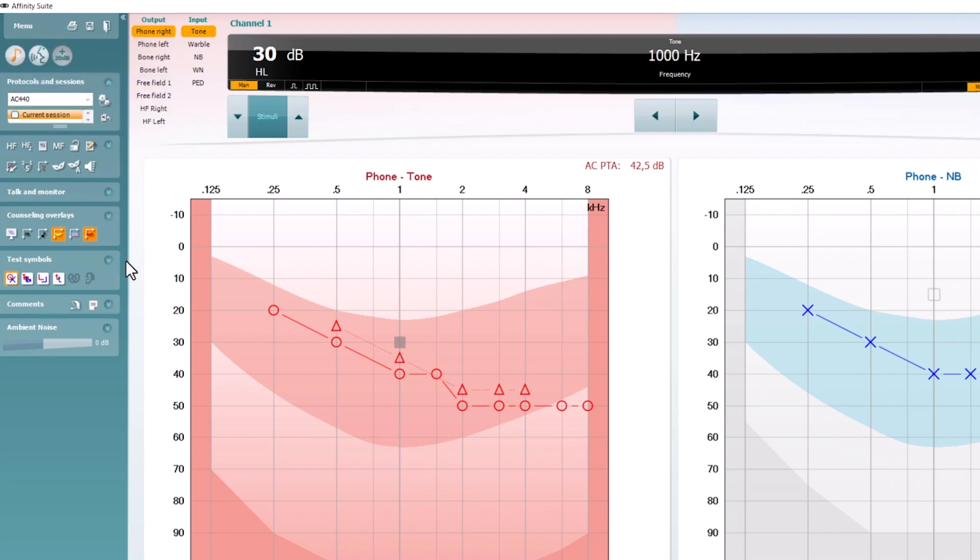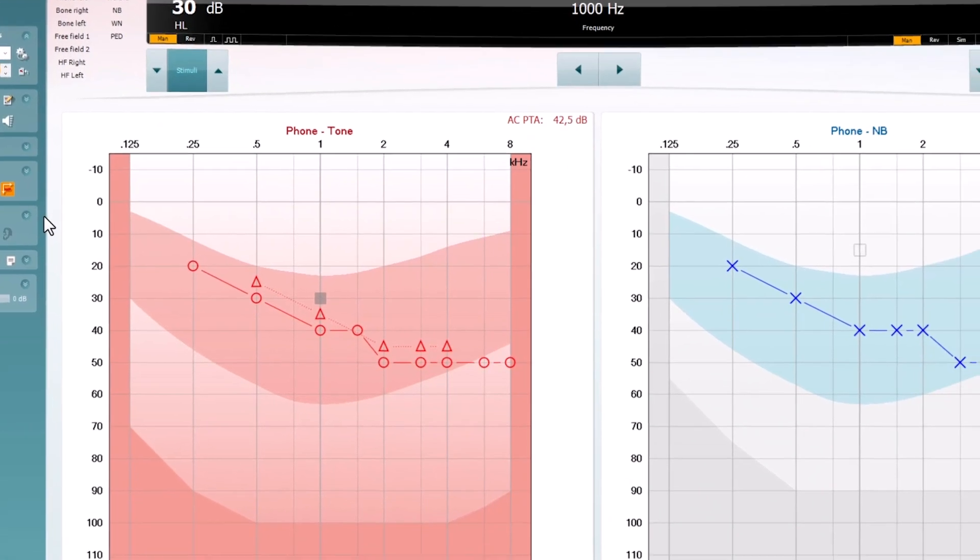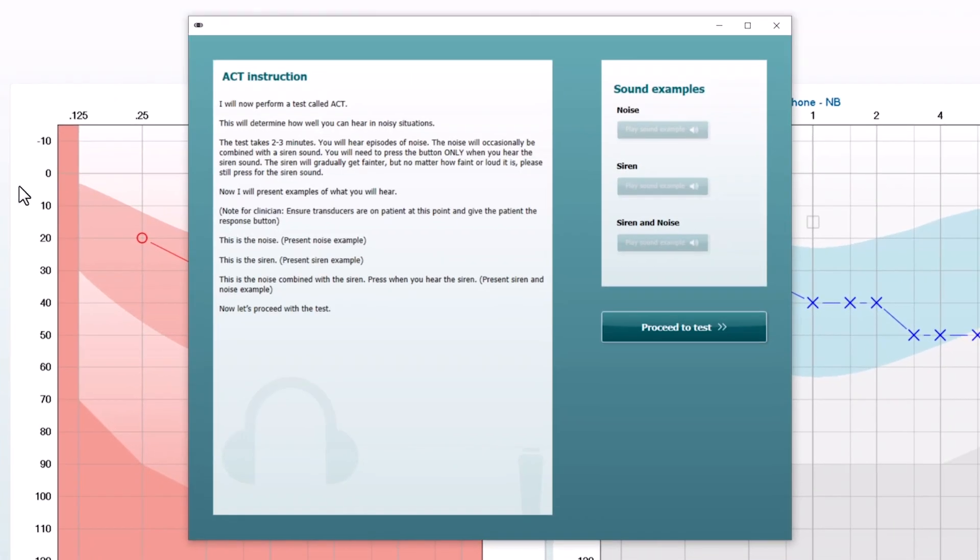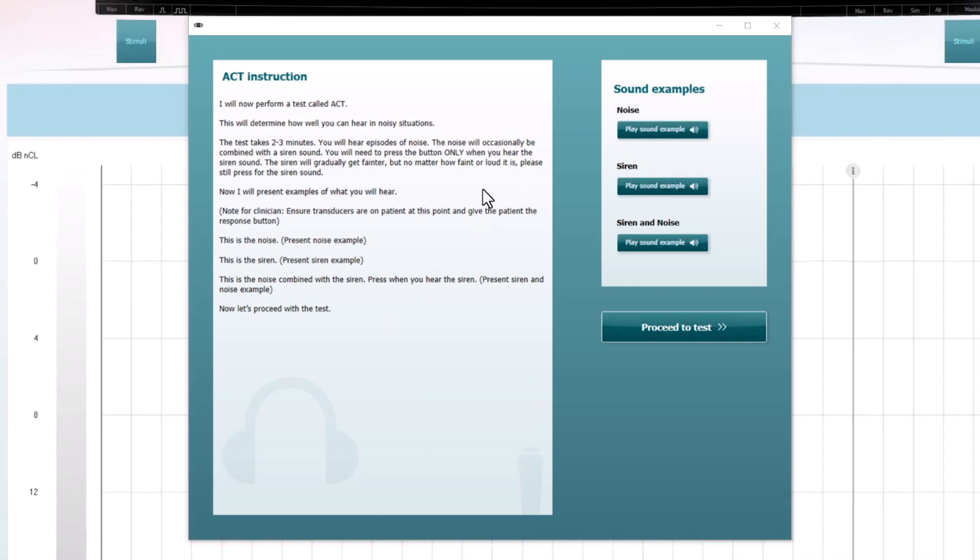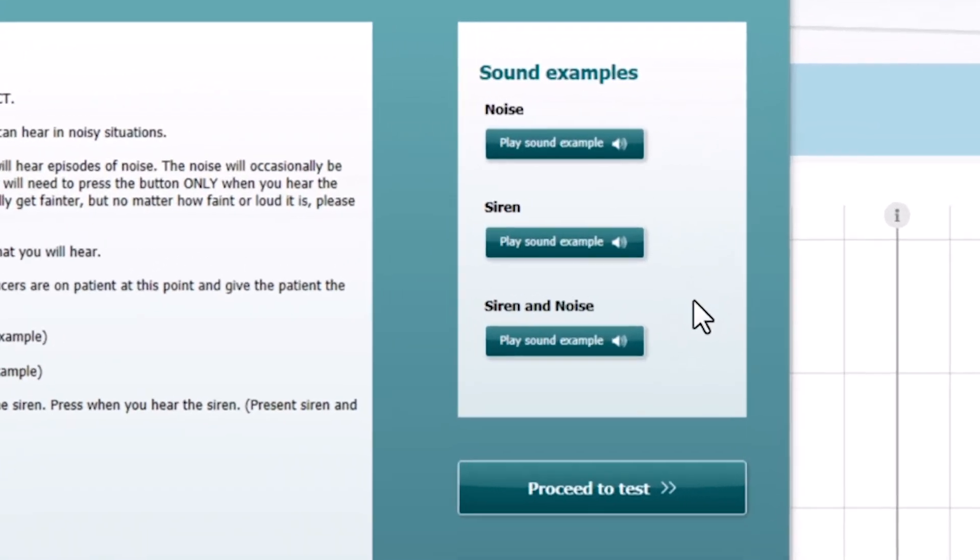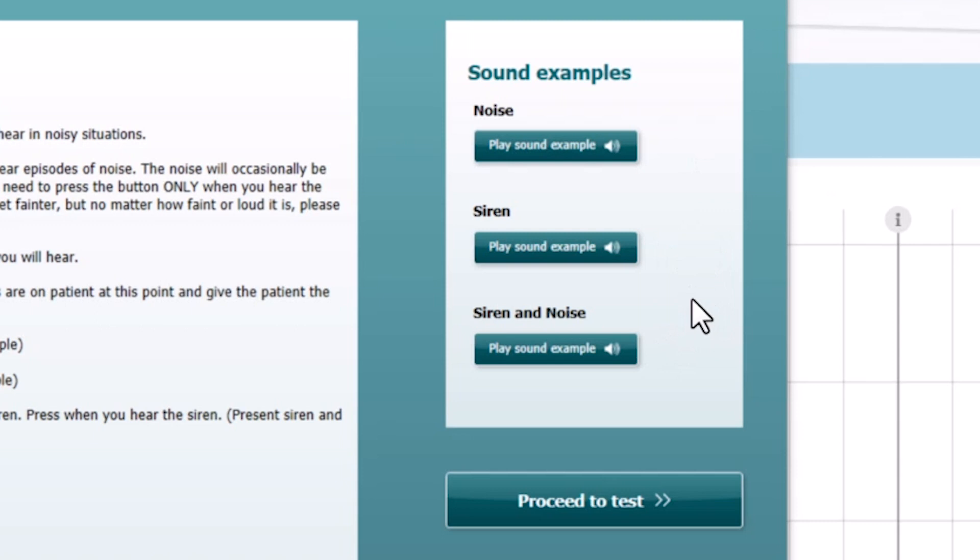An instruction box will automatically appear. Instruct your client on what they need to do and make sure they understand to press every time they hear the special signal, which sounds like a siren. Ensure that you have demonstrated the sound examples so that your client knows what to listen for.